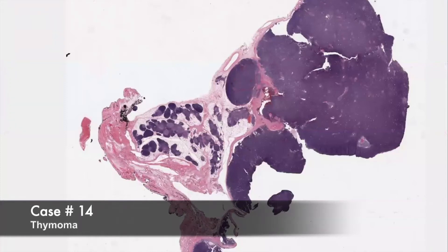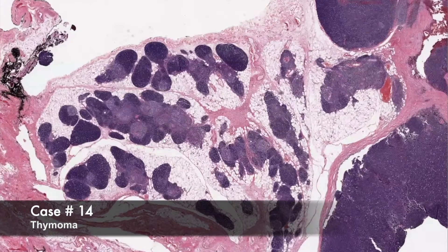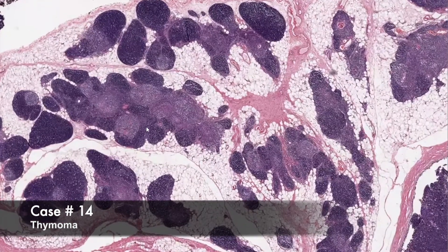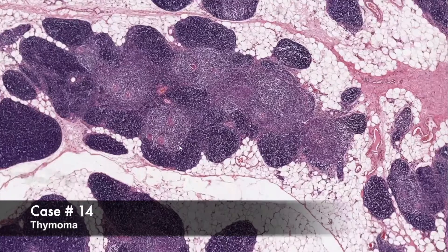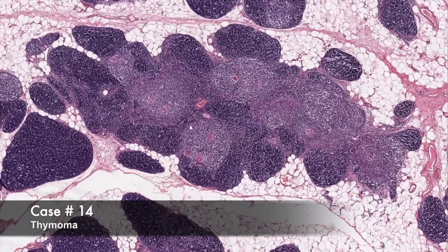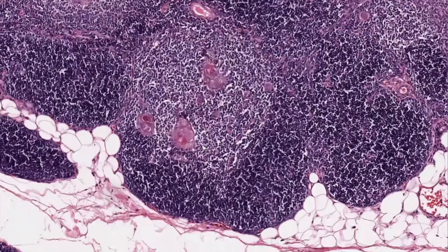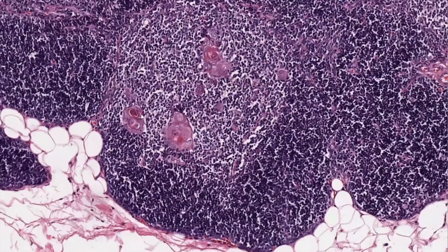Here we have a mediastinal mass and you can see there's a little bit of residual normal thymic tissue. We see this nice lobulated architecture and then a nice contrast between these darker staining areas and these lighter staining areas. We have these dense areas of the cortex and medullary areas that are lighter staining, with Hassall's corpuscles here.